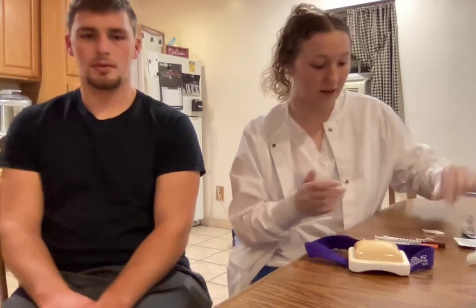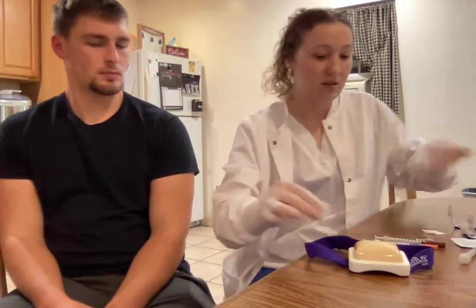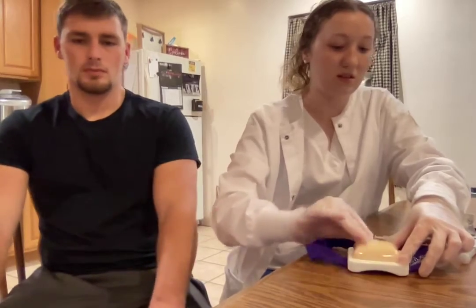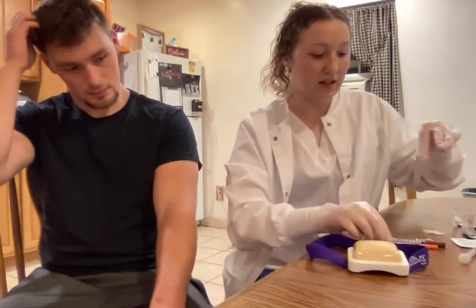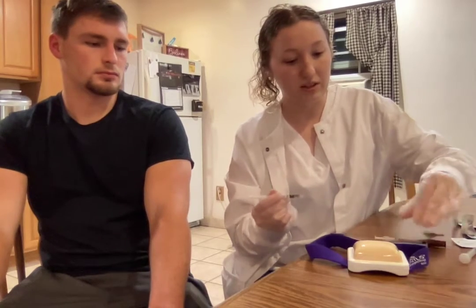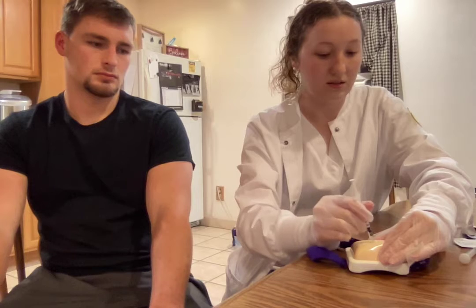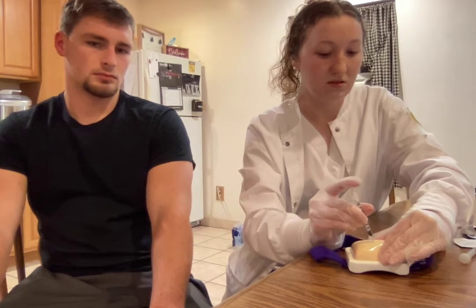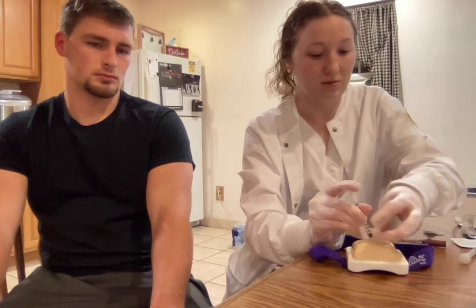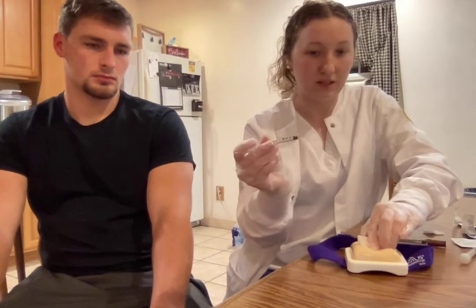So to do a subcutaneous, you're just going to take your alcohol prep pad and prep their skin, and then you're going to take your needle and you're going to go about 45 to 90 degrees. So you're just going to pinch their skin and insert, and then take your prep pad and hold down, and that will go in the sharps container as well.